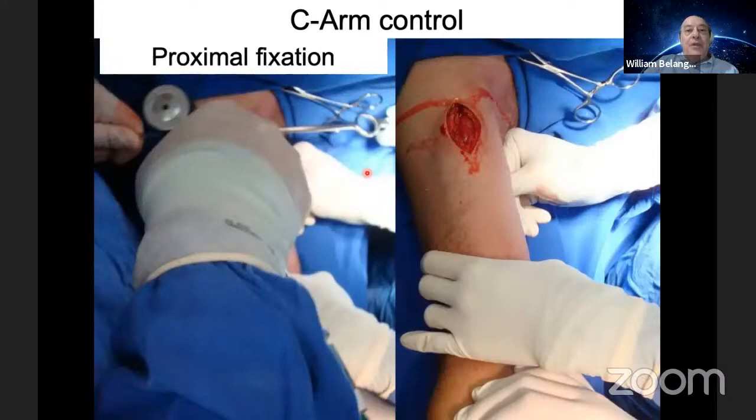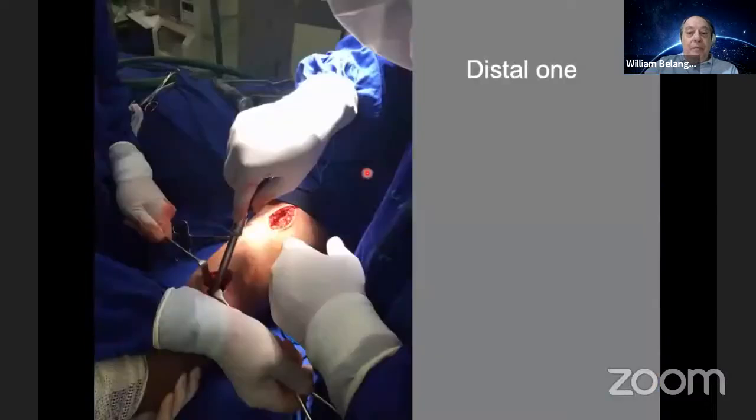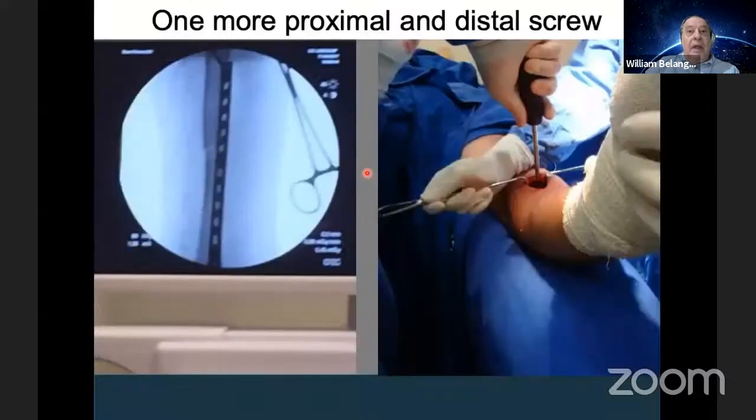Okay, if you are using a cortical screw, and this is one advantage of using a cortical screw, I recommend driving it more proximal to get more bone by the screw. I show you in the case. Then we tighten it completely, and we tighten the distal one. Now it's time to check the quality of the reduction, and again the alignment of the limb and the medial and lateral rotation of the shoulder. Okay, this is the C-arm control.